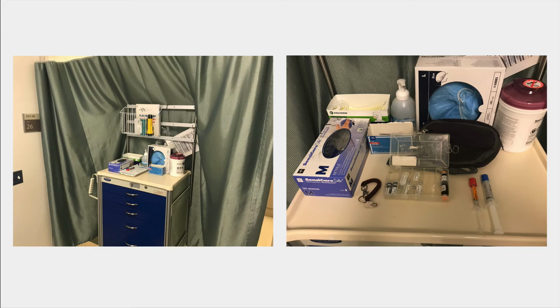Now on the cart, this is just emphasizing the other parts of the equipment that you'll need, one of which is some Versed. We usually draw this up for most people, assuming they're not old and frail. And we also obtain ephedrine because during the epidural placement, patients can either vagal down during needle placement, or you can have some side effects of the medication itself once it's placed. So again, don't forget your pressor, don't forget your Versed.